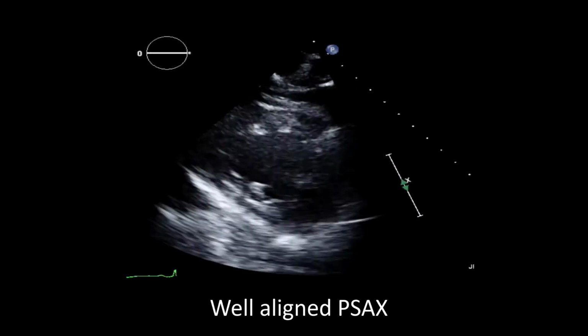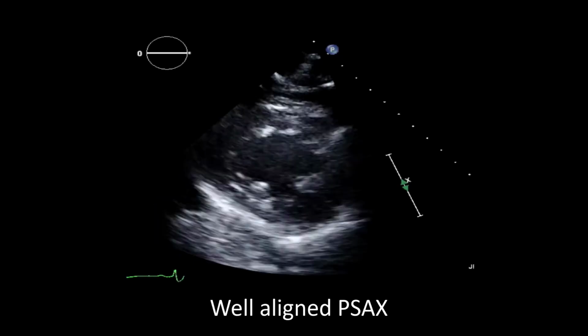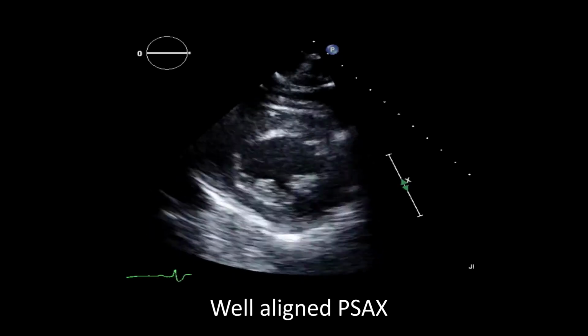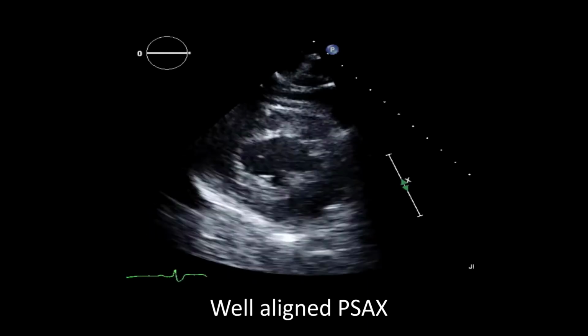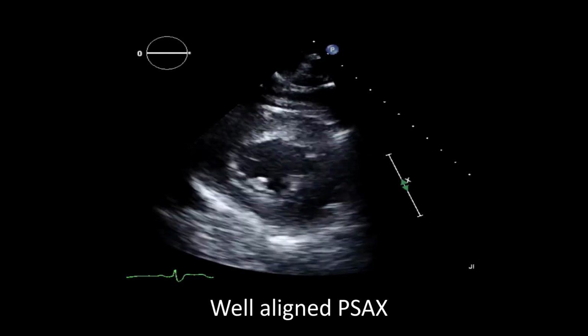This is another example of a reasonably well-aligned and standardized parasternal short axis view. The RV is barely showing here, but the septum is in full sight. This would probably be considered overly acceptable.